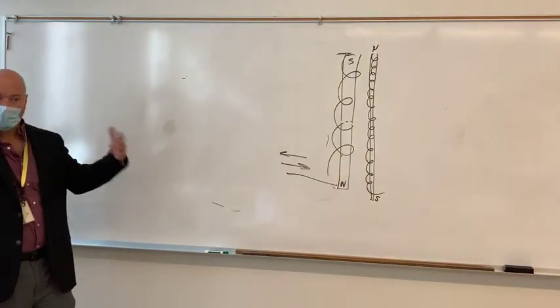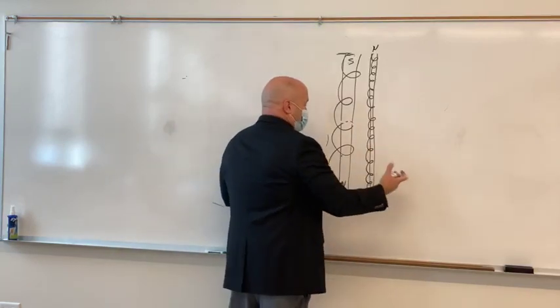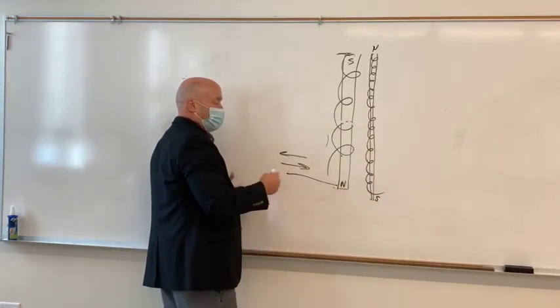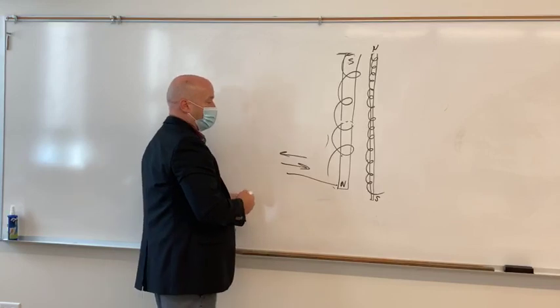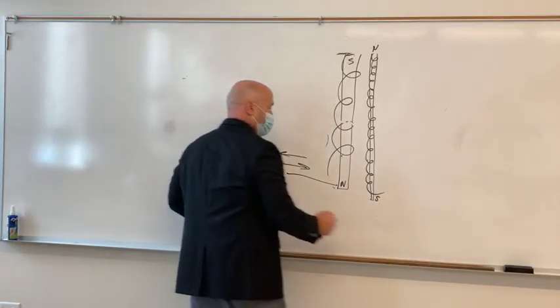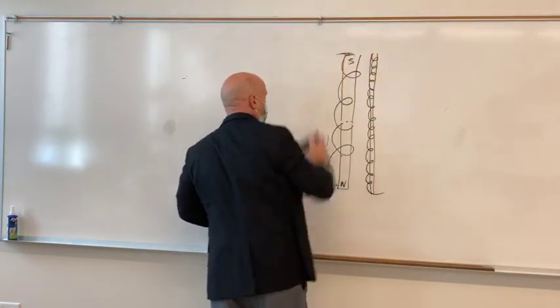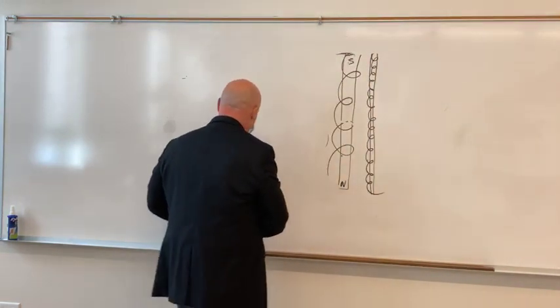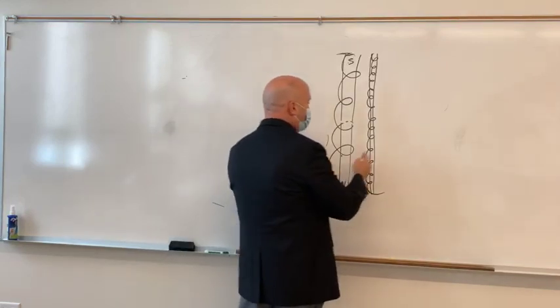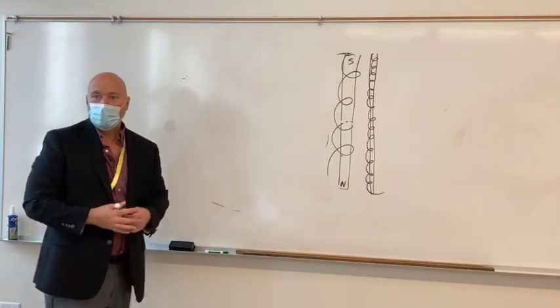All right, so again, hysteresis, we got hysteresis loss. So we got resistance there as well as the foundation for Lenz's law. All right, so what we can do to improve the efficiency is add the core, but in adding the core, again, what we've got are two separate and completely different magnets. What if we could join them up?